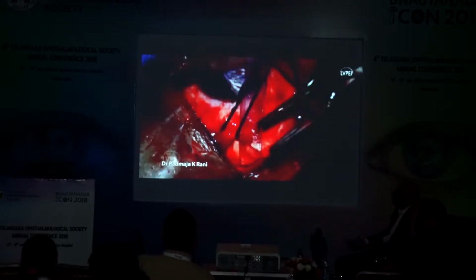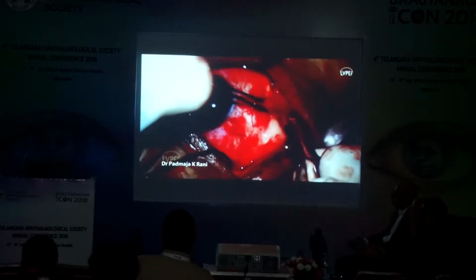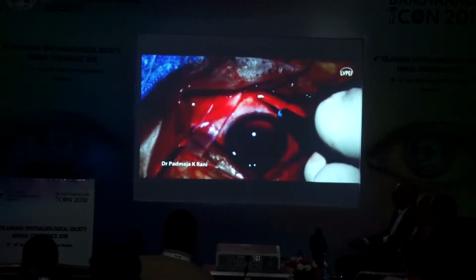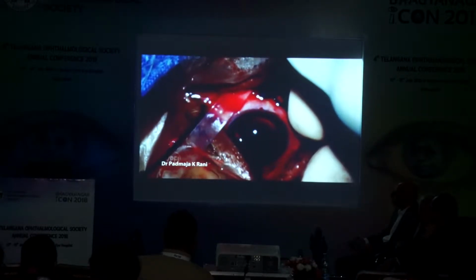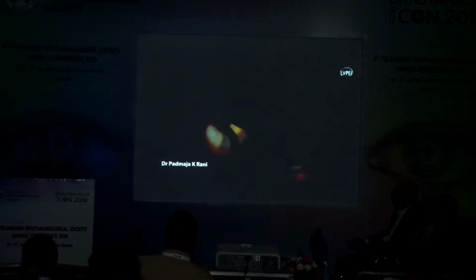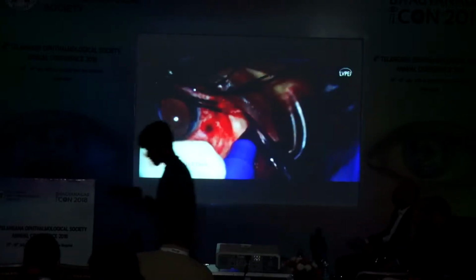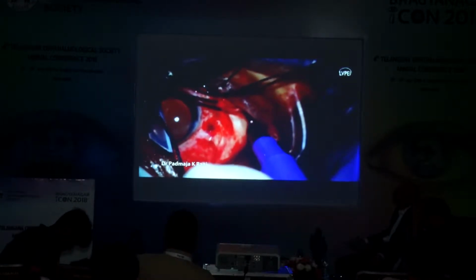The macular wedge was gently positioned under the lateral rectus muscle with its convex side towards the macula and maneuvered till it reaches under the posterior staphyloma. A chandelier illumination was used to accurately localize the macular wedge indentation beneath the macular hole in the posterior staphyloma. Care should be taken to avoid damage to the vortex veins, perforating the globe, and injuring the optic nerve. The appropriate location of the macular buckle was marked with a sterile ink marker.